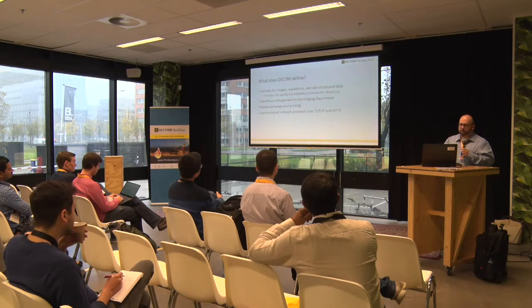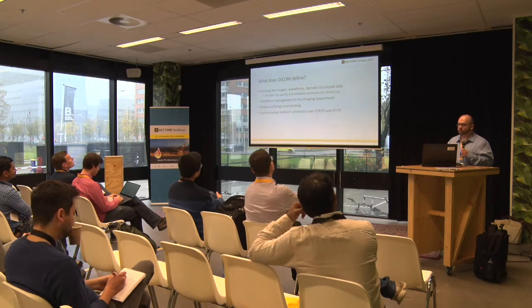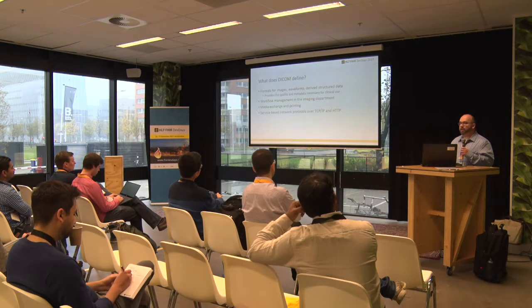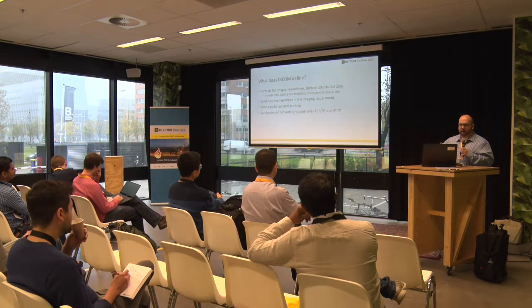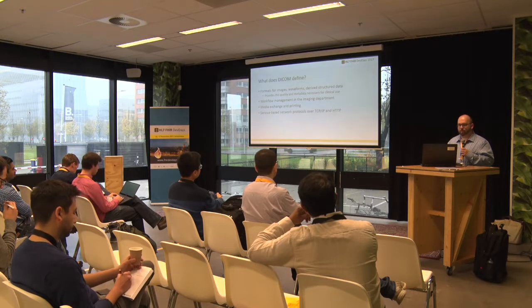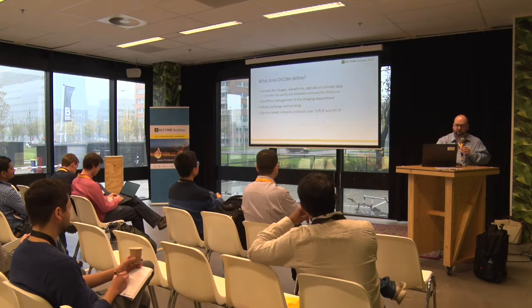DICOM defines formats for imaging, waveforms, and derived structured data, and provides the quality and metadata necessary for clinical use of those images. So you think, well, you can't just use JPEGs. There's a whole bunch of wrapper data around that describes how the image was captured and what the image was acquired for. DICOM also defines workflow, as well as media exchange and printing, and it's all based on TCP/IP and then also HTTP, which I'll talk about with DICOMweb.